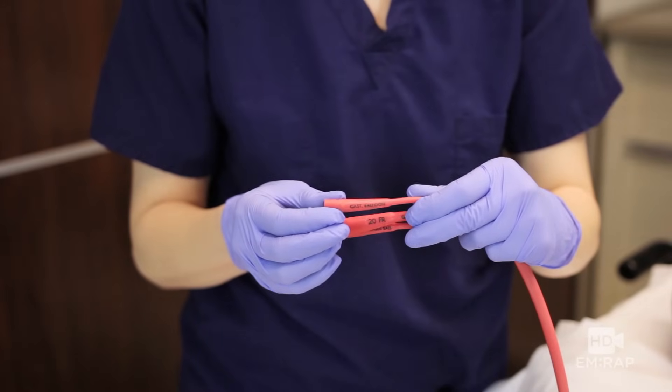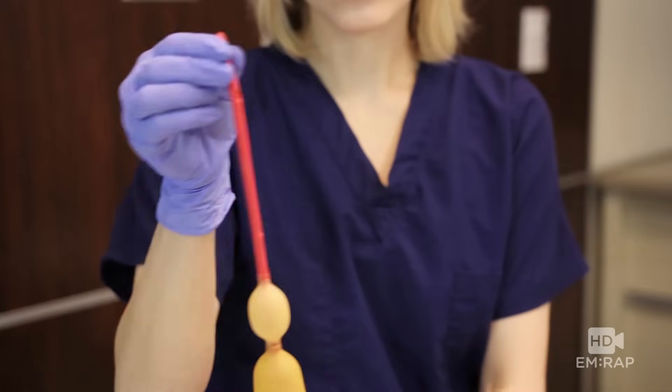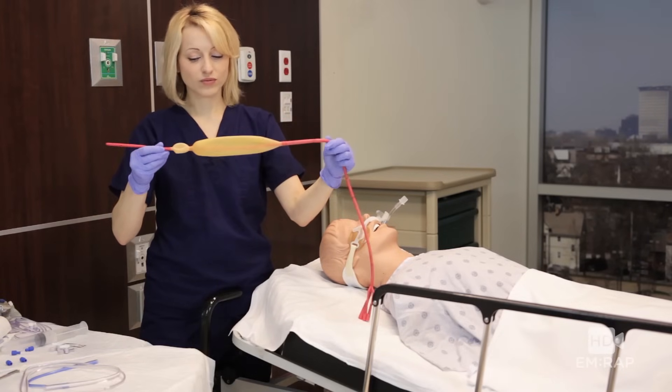There are three ports: one for blowing up the stomach balloon, one for the esophagus balloon, and one for suctioning the stomach. There are suction holes for the stomach, no suction holes for the esophagus, and two balloons — one for the stomach and one for the esophagus.